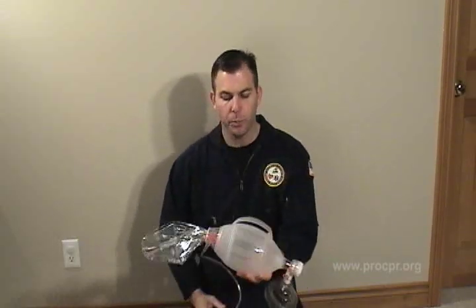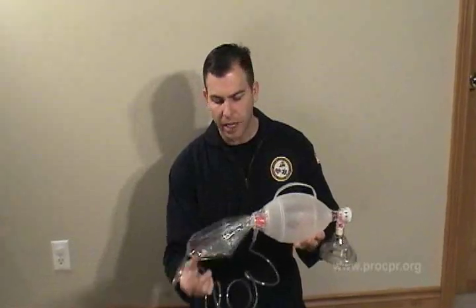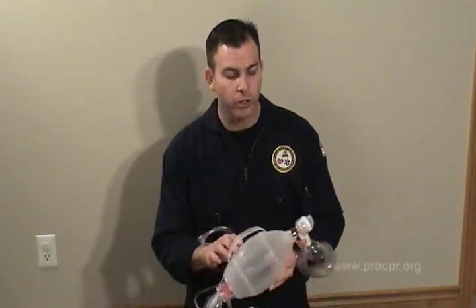In this segment, we're going to overview bag valve mask use. In this particular bag valve mask, you'll notice that there's not only a reservoir on the end of it, there's also oxygen tubing, and for good reason. It needs to be attached to supplemental oxygen, high flow O2, in order to deliver the maximum amount of oxygenation to the patient when using this tool.